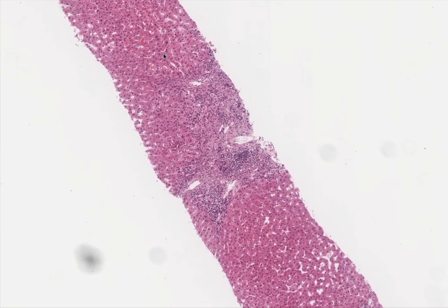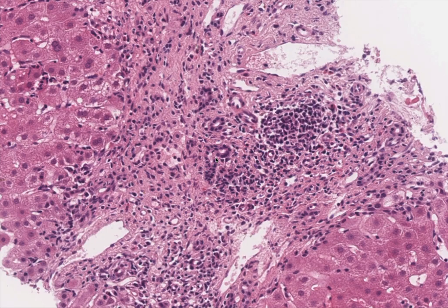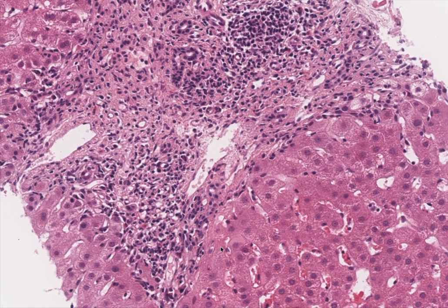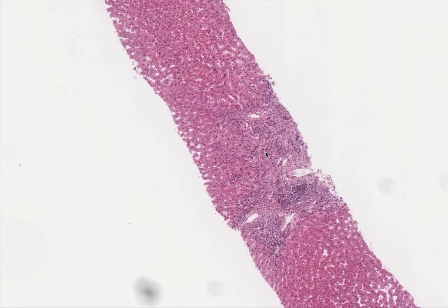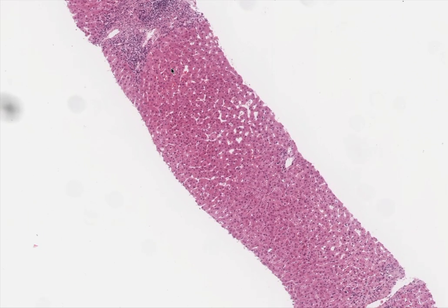Let's move on a bit more. Again, we've got probably normal lymphatics through here, normal bile ducts, again predominantly lymphocytic infiltration, slightly less interface hepatitis through here, but very active interface hepatitis through here. So I'm thinking that this is chronic active hepatitis, and now I've got to find out why.